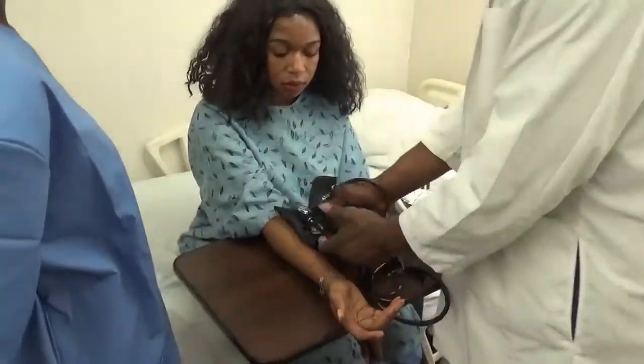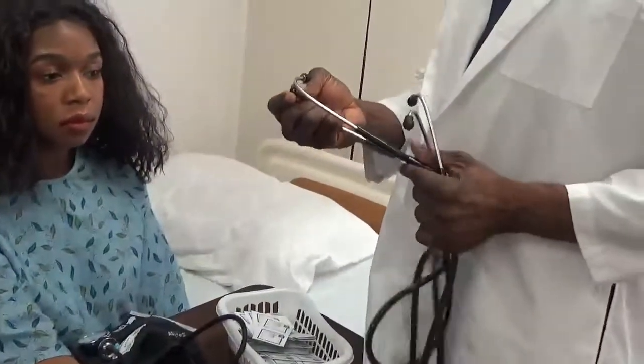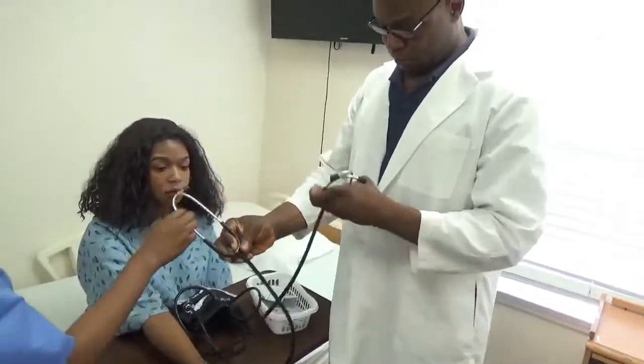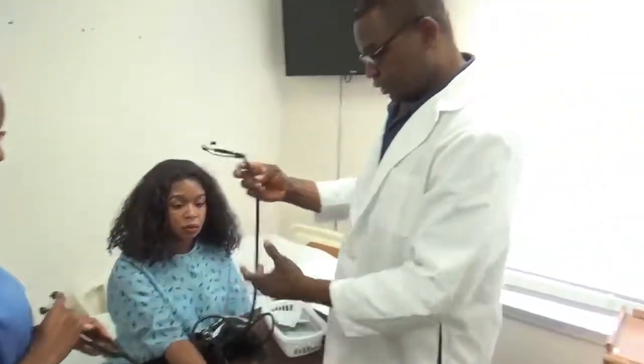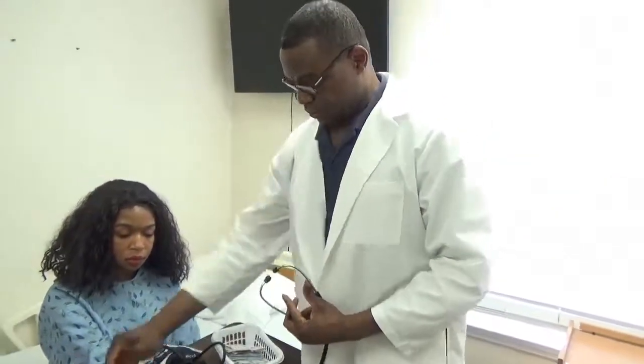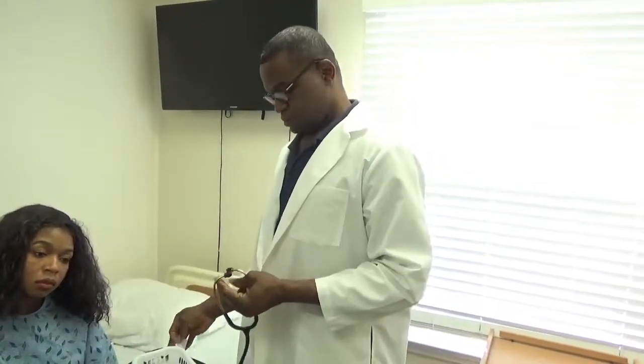So the first thing that you're going to do, if the examiner does not wipe her stethoscope, then you need to wipe it for her. So you start wiping yours first. Make sure they don't get twisted. So wipe your stethoscope. Use one pad per earpiece, because several people use the stethoscope, so you need to wipe it. Get another one and wipe.